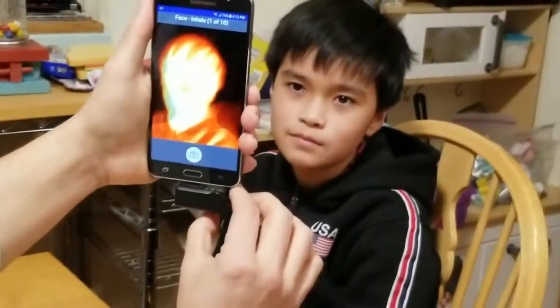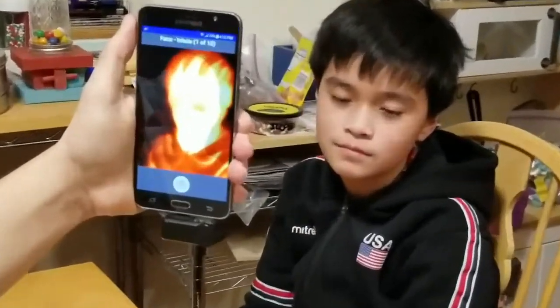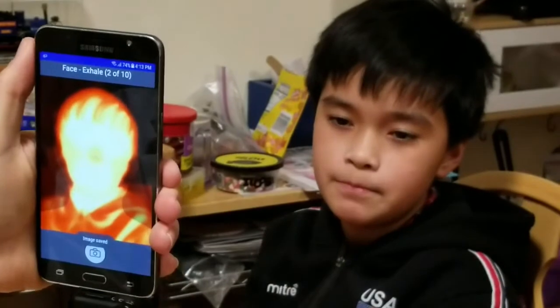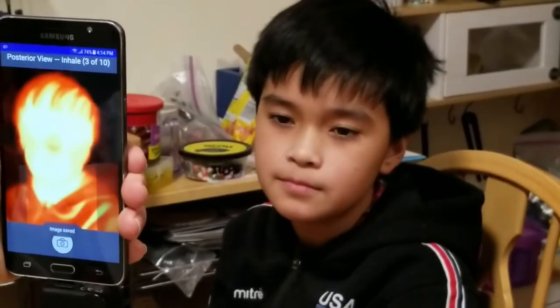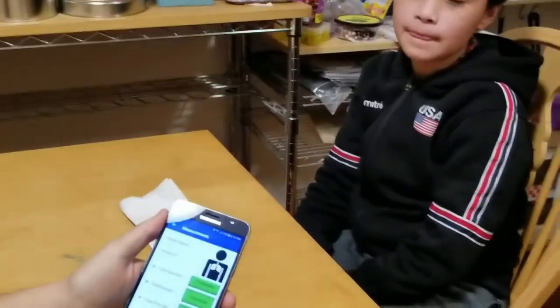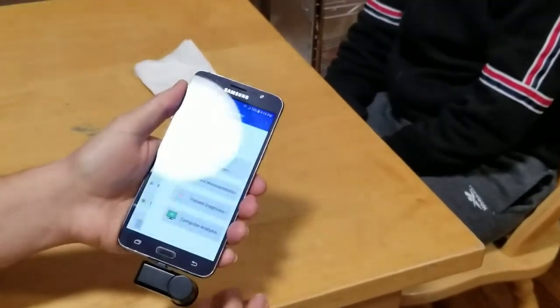Okay, so I'm now focusing on your face. That's pretty good. Okay, please take a deep breath in and hold it. Hold. Very good. Now exhale. Very good. Okay, great. So we are done with this part of the exam. And we have completed all 4 tests. So I'm going to click done.